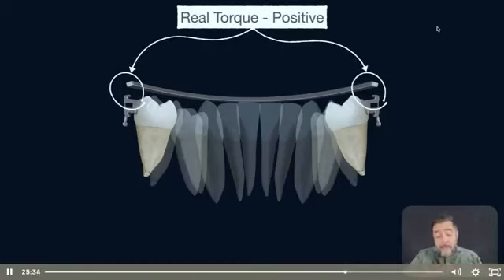We must flatten the wire on the glass slab, because we don't want vertical displacement of the teeth, because we have already leveled and aligned the teeth, and we don't want vertical displacement of the wire. That's why we need to do that at all times. We need to flatten the wire on the glass slab and check it.